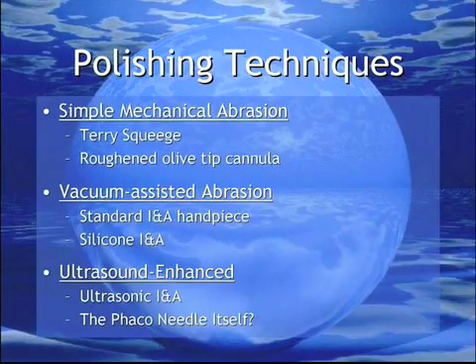Methods of capsule polishing encompass differing mechanisms to achieve this goal. Mechanical abrasion may involve a terry squeegee or a roughened olive-tipped cannula. Adding vacuum stabilizes the capsule against either a standard or silicone-tipped I&A handpiece. Lastly, adding ultrasound to the I&A handpiece has been attempted before. But what of using the phaco needle to polish the capsule?